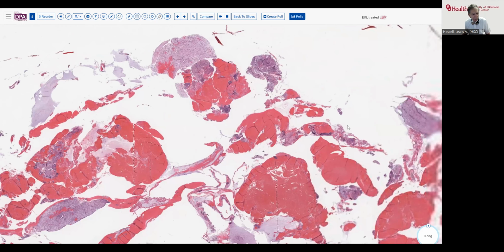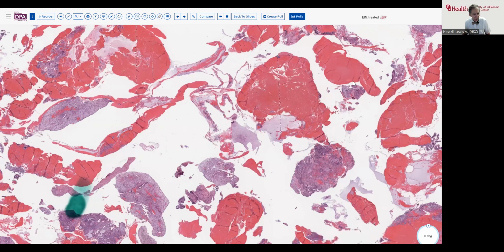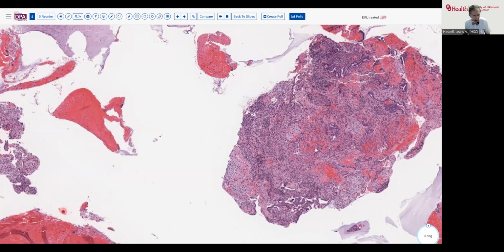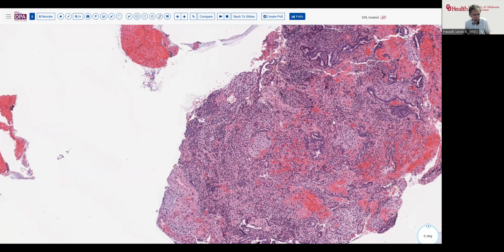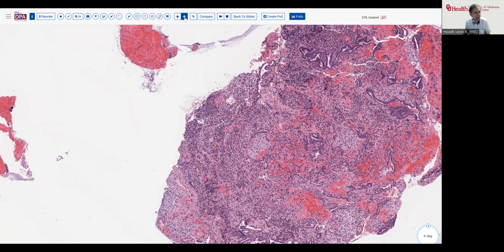They can be quite focal. And so you need to have a high index of suspicion. You need that history, and you need to examine the multiple levels and look at things more carefully. Now, this fragment, for example, I don't think we could make the diagnosis of atypical hyperplasia, even though it looks different. This may be more like lower uterine segment, where we don't have much of the endometrial stroma.